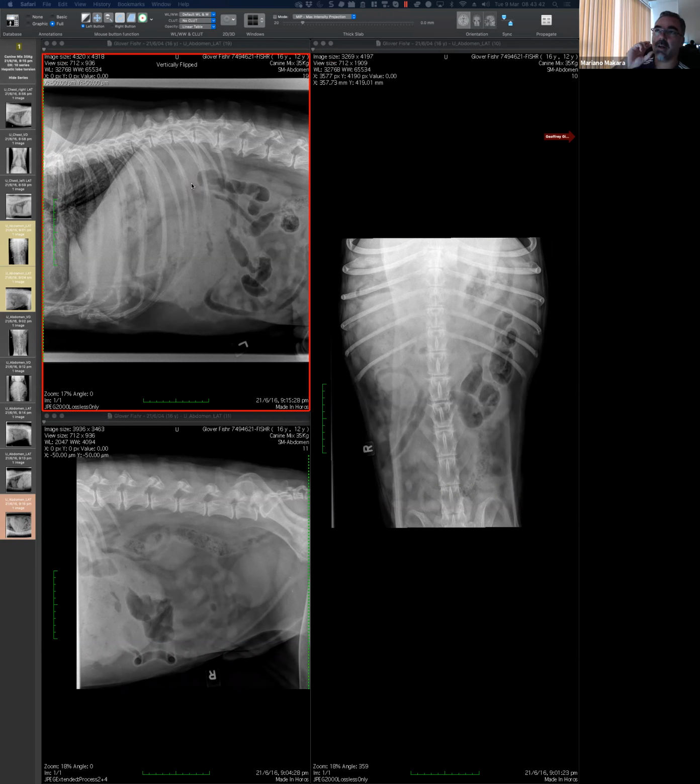This was a hepatic lobe torsion. So it's kind of breaking some rules, and that's why I liked it a bit. Which lobe? Say it again. Could you repeat what the diagnosis was? It was a liver lobe torsion.